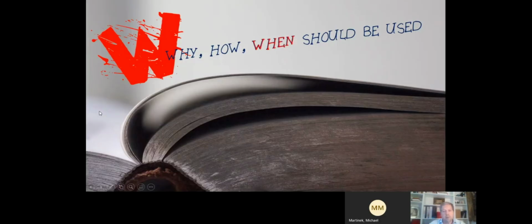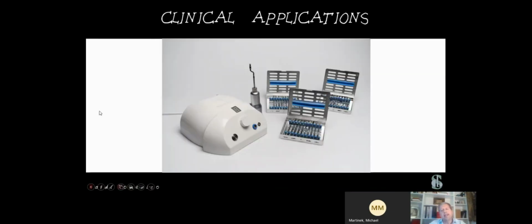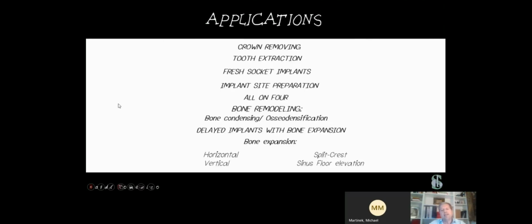The other question is when we have to use this instrument. And so we can analyze the clinical application. And we know that the possibilities that we have are very huge. In fact, we can use this instrument also in order to remove the crown, the bridge, but we use it fundamentally in our surgery.